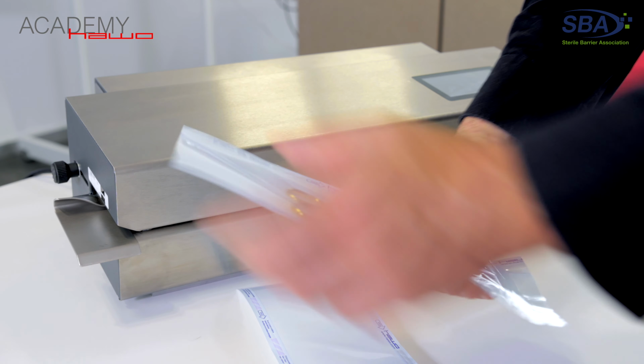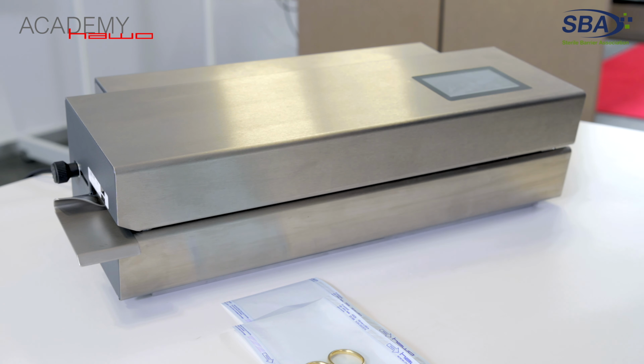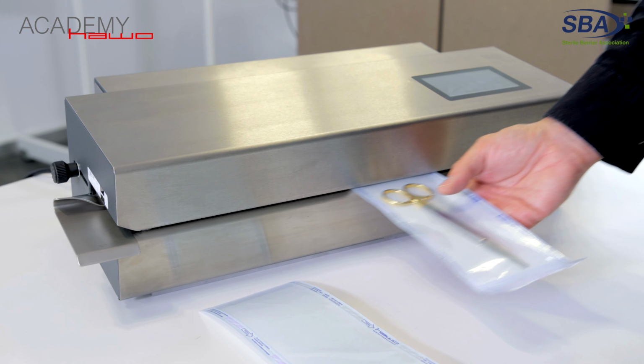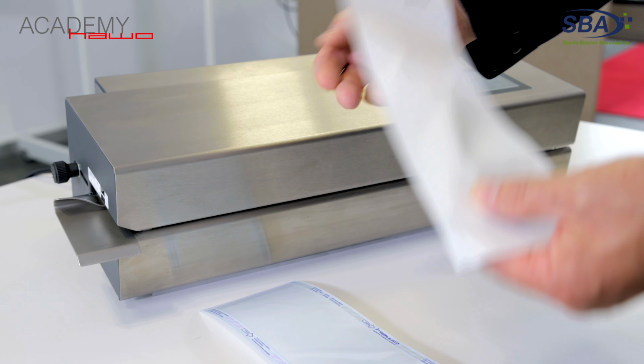Now we will be doing packaging. However, as we do want to print those new symbols, I will switch the printer function on again and allow for pouch transfer and printing at the same time.